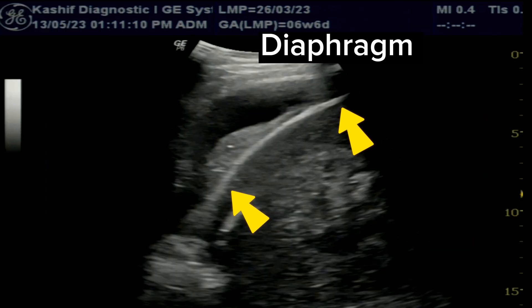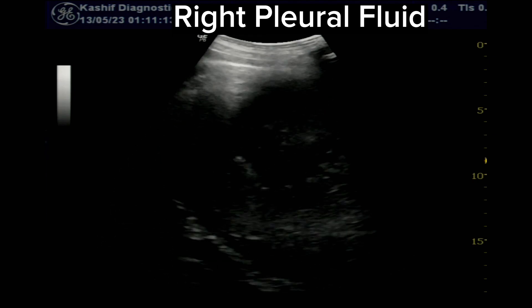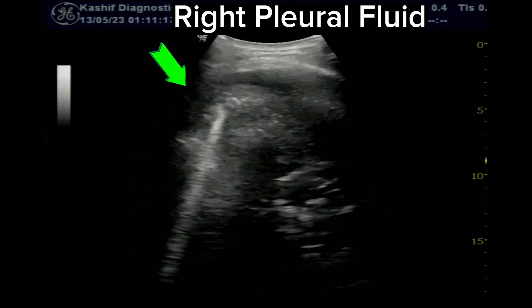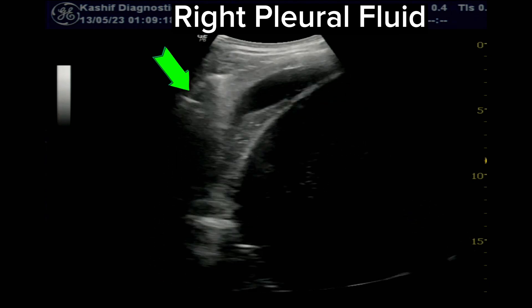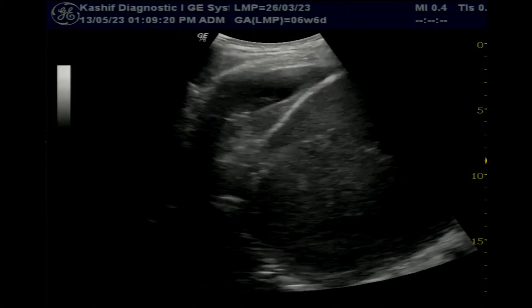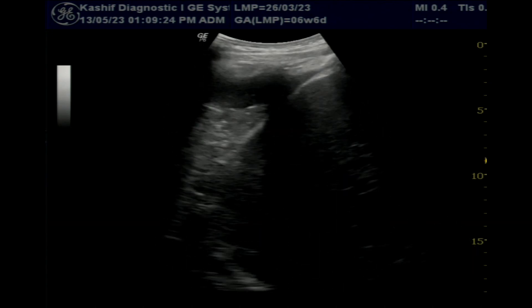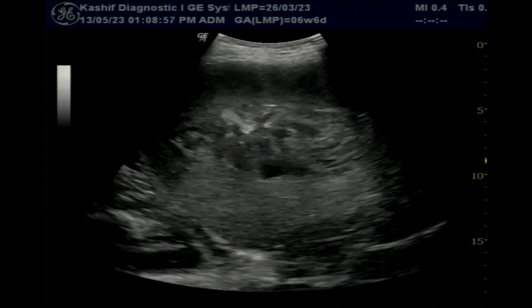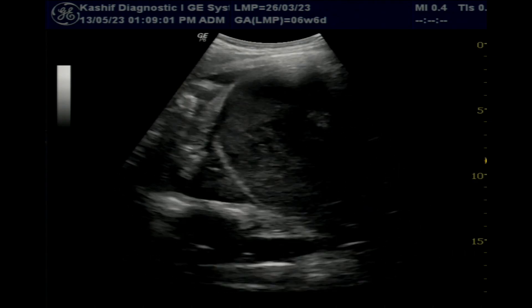Note the right pleural fluid in the lower zone. The diaphragm is intact, so the main cause of this fluid is reactive. If not treated timely, extrahepatic pathology can be present in many patients. These include lung involvement, perihepatic fluid collection, GIT involvement, and retroperitoneal extension.